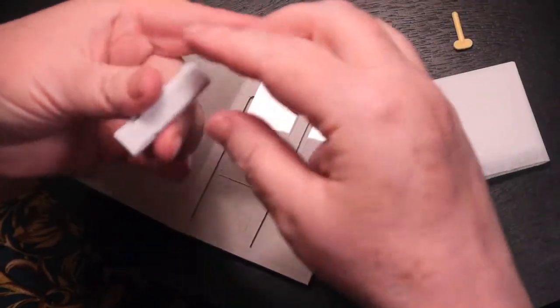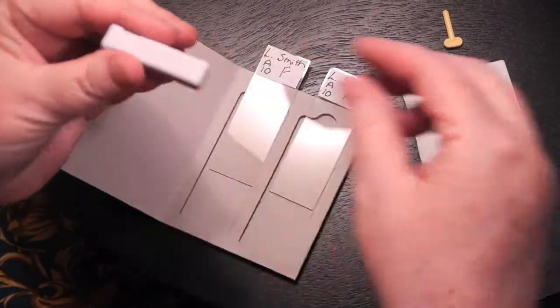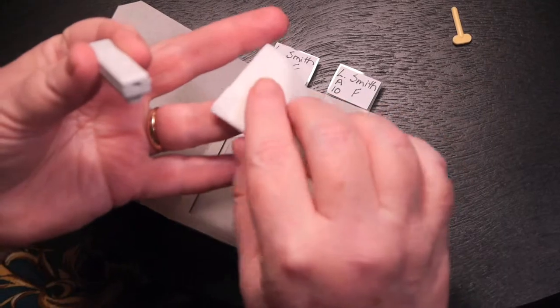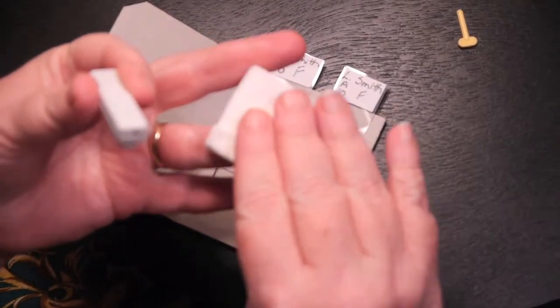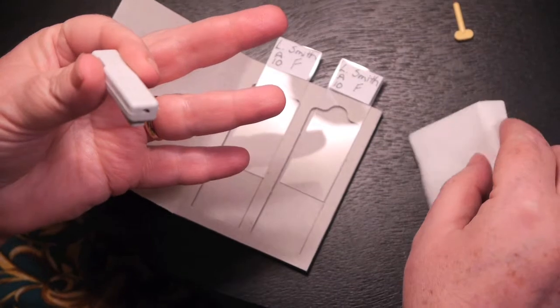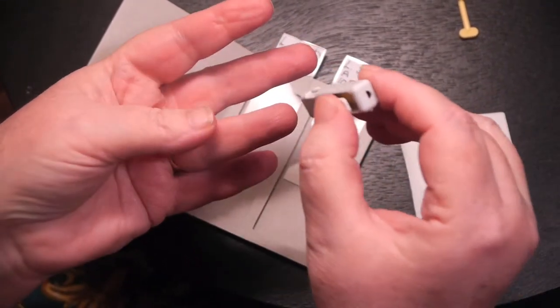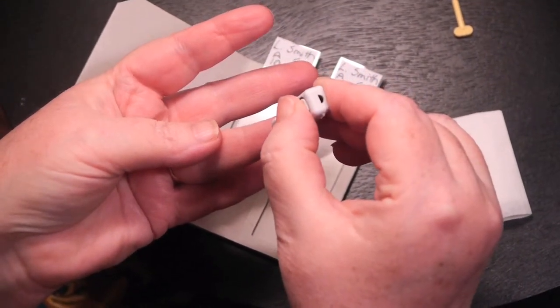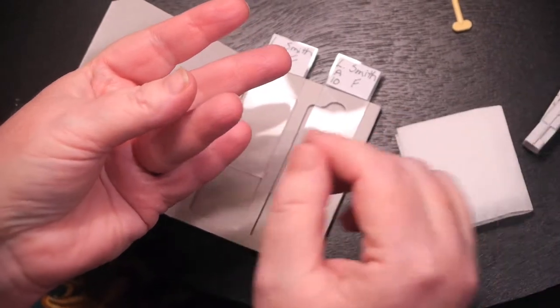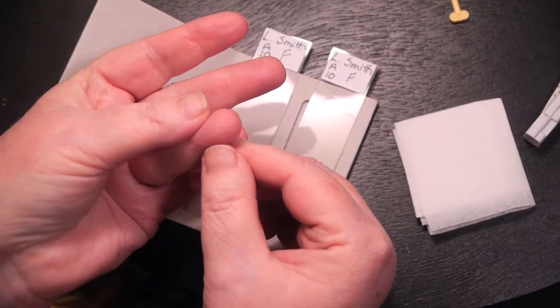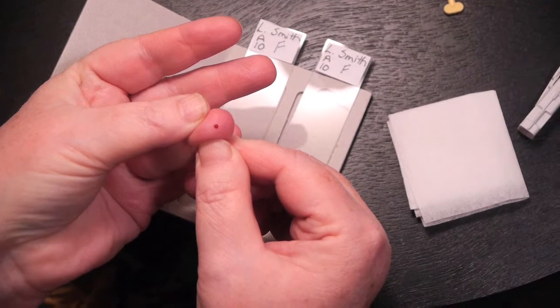First, you'll want to choose your non-writing hand. Use the included paper towel to clean the skin. Connect the lancet with the surface of your finger - you don't have to push too hard, just so they connect - and push the button on the lancet. You may need to gently squeeze your finger to let the blood come up.